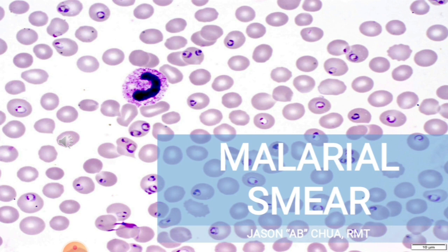Trypanosoma and Microfilariae can be detected by observing motility in a wet mount preparation of a fresh blood sample under low-power objective and high-power objective. However, definitive identification requires demonstrating their features in a permanent stain smear. Blood smears can be prepared from fresh whole blood without anticoagulant, using your fingertip or earlobe, or from venipuncture collection with anticoagulant.